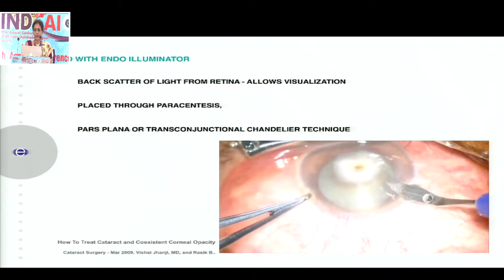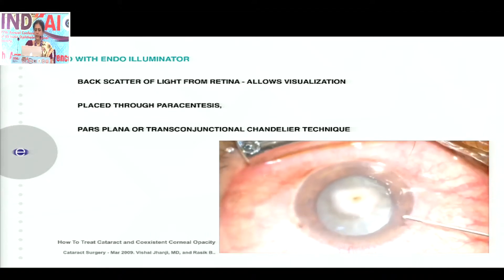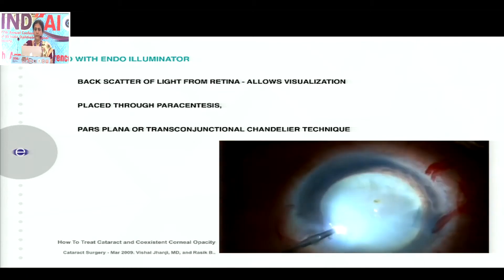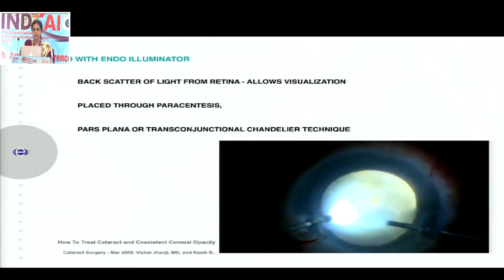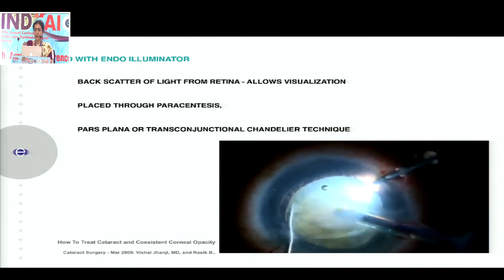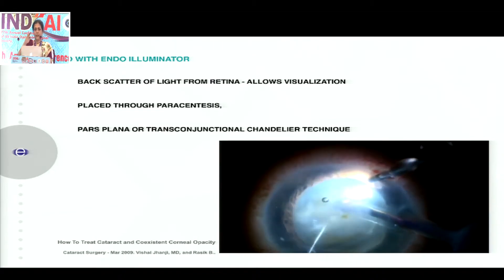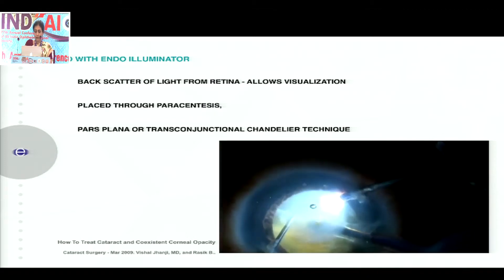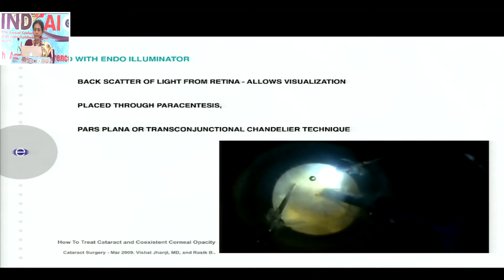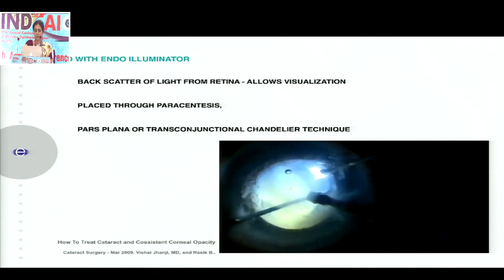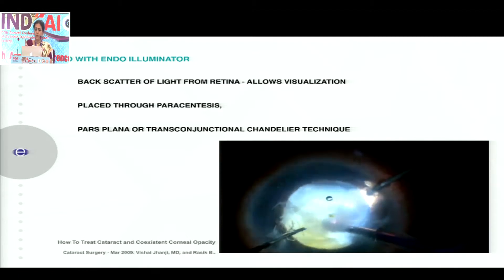Another approach when dealing with a patient with corneal opacity: make your main port, inject your dye, do your side ports, and do your capsulorhexis. Before the rhexis, you can use an endoilluminator — placed intracamerally or through the pars plana route — where back reflection of light from the retina provides oblique illumination. This gives greater depth of focus compared to the limited coaxial illumination of the microscope. You are able to do a good rhexis, perceive the fragmentation occurring, and see the posterior capsule below, allowing you to proceed with greater care.